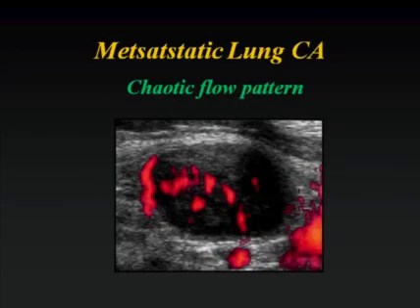Here's just another patient with chaotic flow pattern. It's often quite hard to give morphologic descriptors of the flow patterns. It's just that they look very different than the very subtle central pattern.